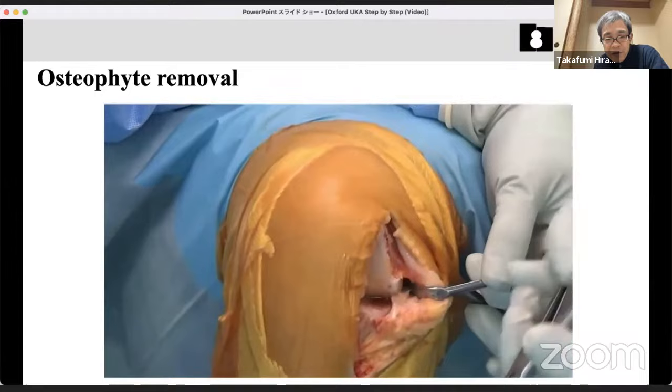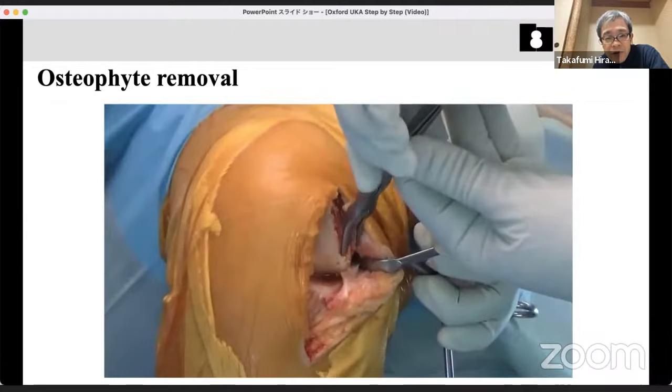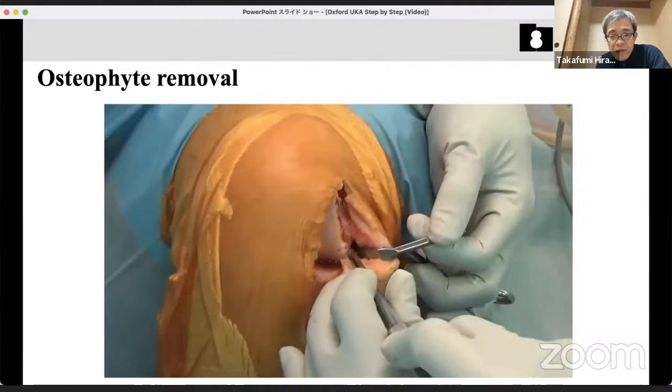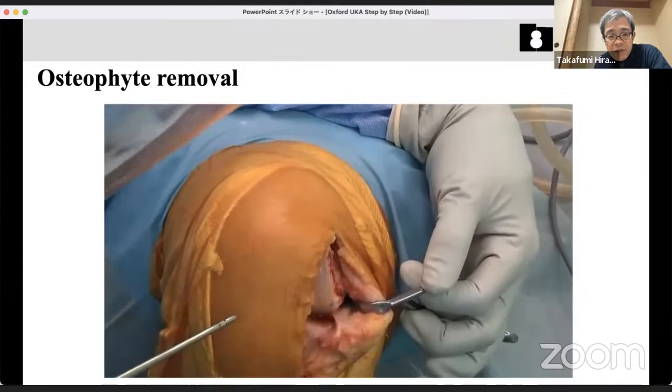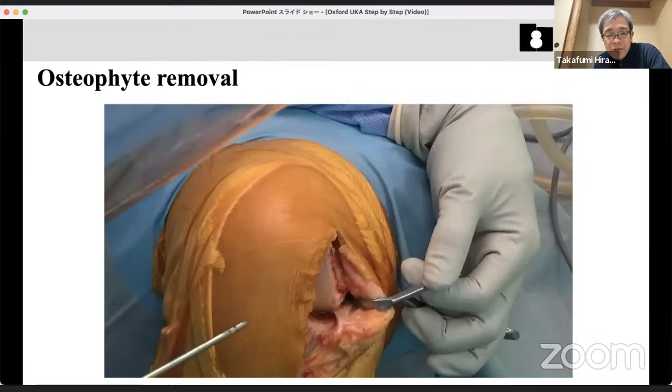Between the MCL and the medial condyle, use a small chisel while protecting the MCL. Take care to never damage the insertion of the MCL. You should remove the osteophyte here completely. Protecting the MCL and completely removing the osteophyte is very important.